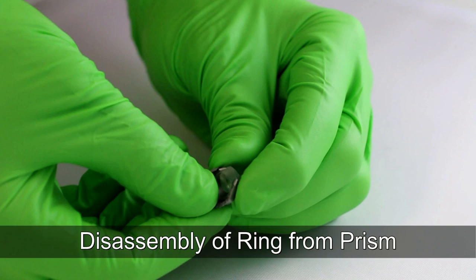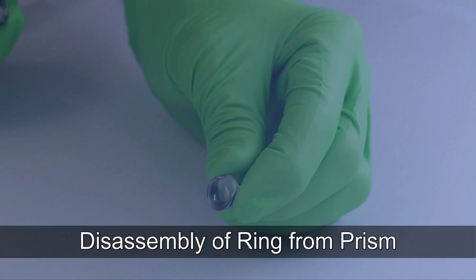To easily disassemble the ring from the prism, first with both hands hold the ring head of the stabilizer, then twist the ring in a counter-clockwise motion. This will properly release the ring from the prism.